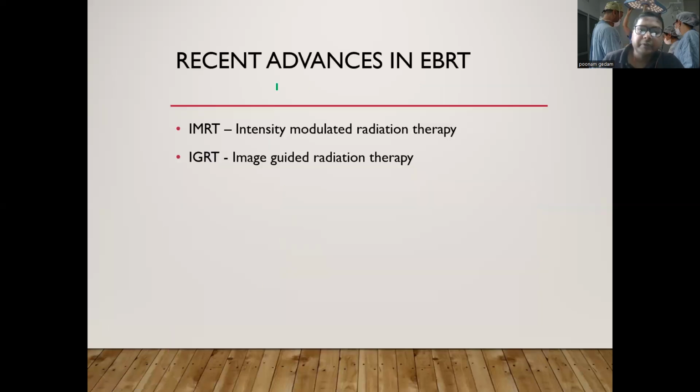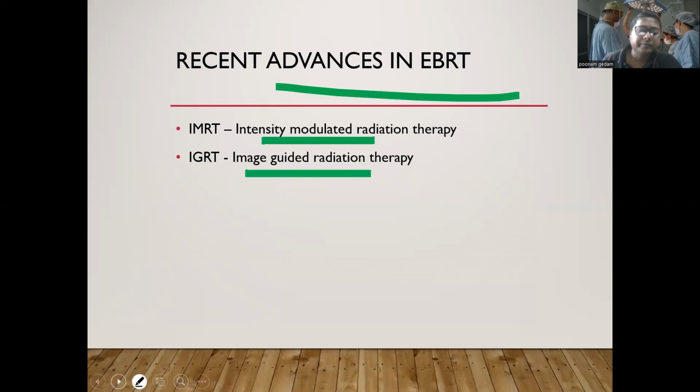So coming to the recent advances in external beam radiotherapy: IMRT, intensity modulated radiation therapy, with least side effects. This is most commonly used. IGRT, image guided radiation therapy.